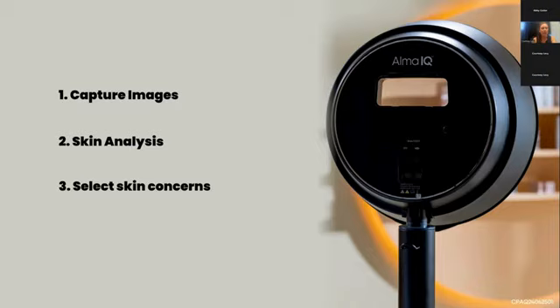We then do what is unique in the Alma IQ as a skin analysis system, and this is that we have the skin concerns in the system and a built-in decision tree to help clinicians decide which energy-based system of Alma is the most appropriate treatment for their patient.